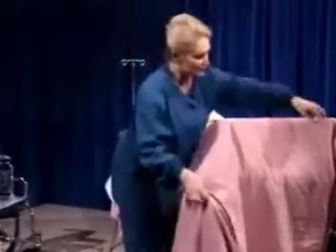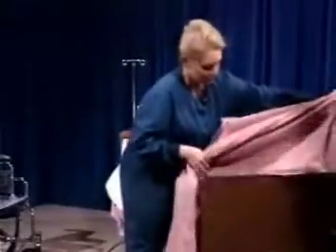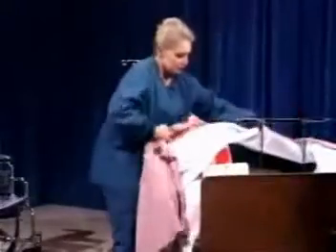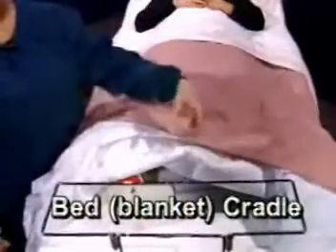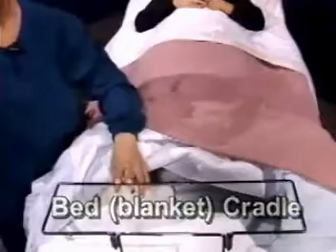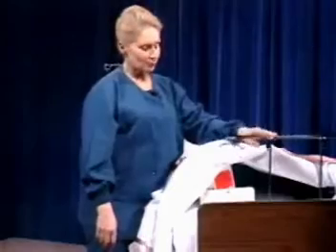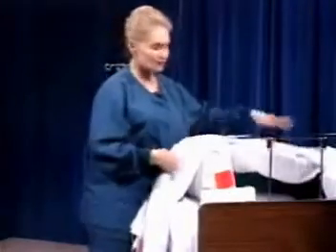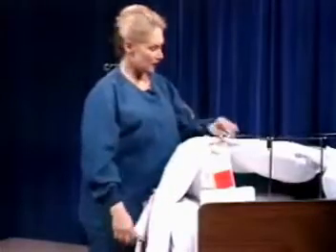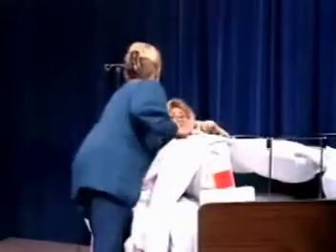I'm going to remove the blankets now and show you the frame of the cradle. This is just one type of blanket cradle. There are others that have brackets that are attached to the mattress, and there's a tension wire that goes over the sides, and over that the blankets are placed to help take all the weight off the patient's feet. Now we're going to turn our attention to what an A-frame is.